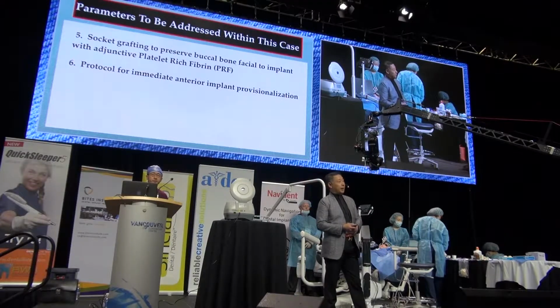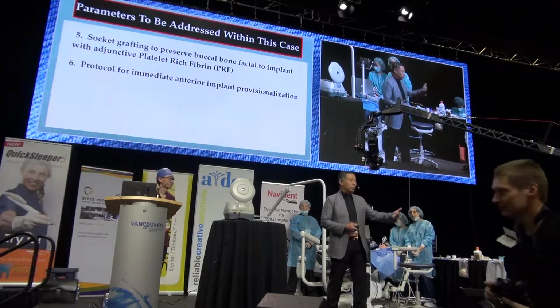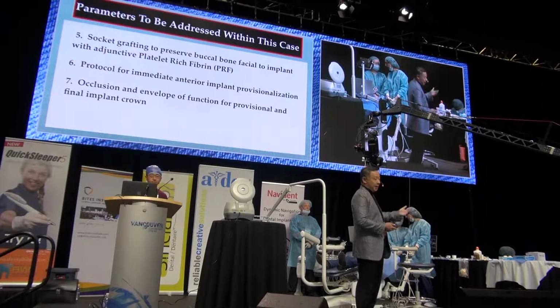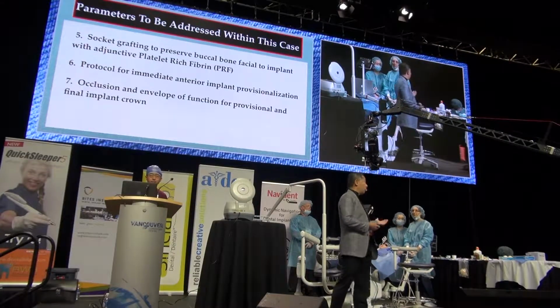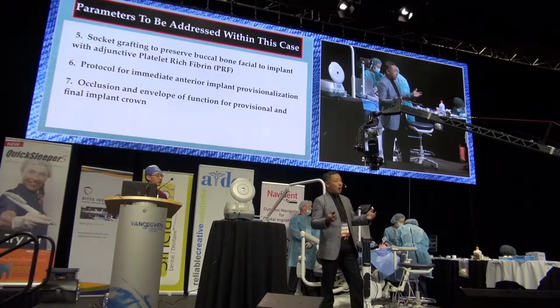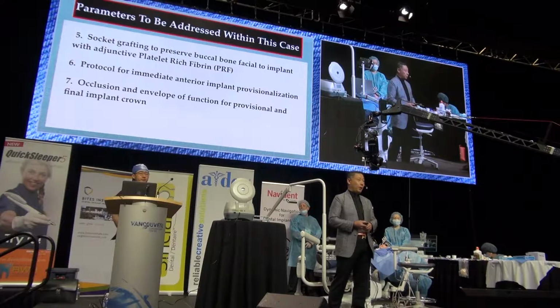If and when the implant gets locked in with what we call primary stability, Dr. Kwan will do what we call immediate provisionalization over this case. And very importantly, we started talking about why these teeth break. I want to give a rationale for what kind of occlusion is needed and why these teeth break.